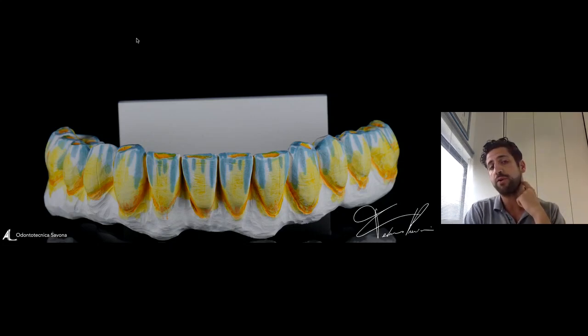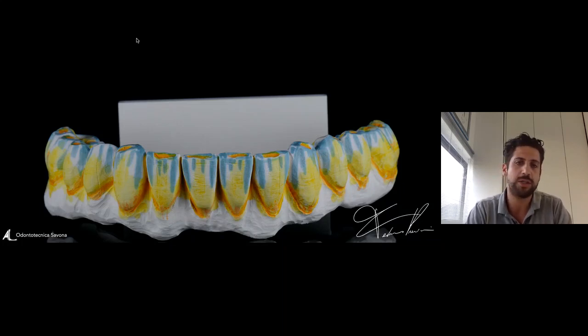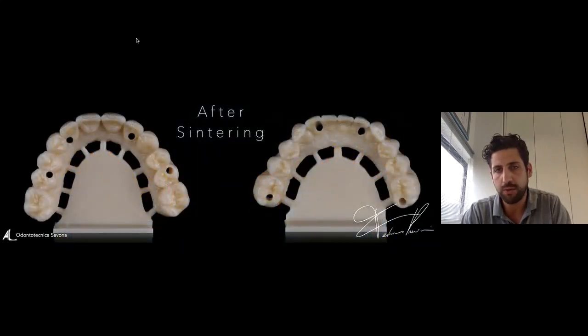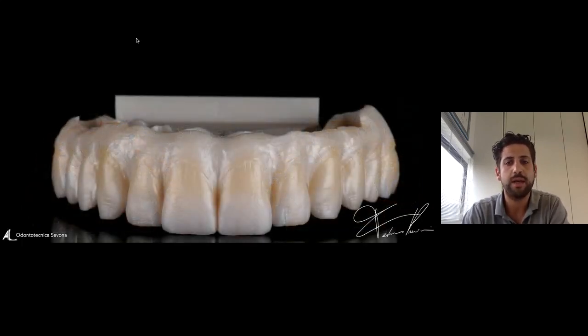Also really important, for example, this was a Prettau 2 Dispersive A2, but I also prefer to put some color to make our restoration more natural. We put a little bit of orange, base A, and also some blue in the incisal edge. This is the upper jaw, and this is the result after the sintering. Okay, we can see the difference between the incisal edge and the cervical. We have a little bit more chroma in the cervical side and a little bit more translucency in the incisal edge.